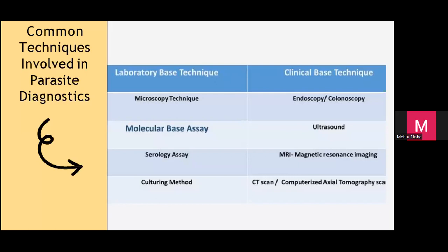Okay, microscopy. Sebab you know already the size is so big. In fact, untuk Ascaris kalau cacing tu you tak payah mikroskop pun. Kalau dah tengok pun dalam bekas kita dah tahu. Tapi kalau nak tengok ova dia, the eggs, trichuris Ascaris, you can just see in the microscope. So microscopy is the best. Okay.